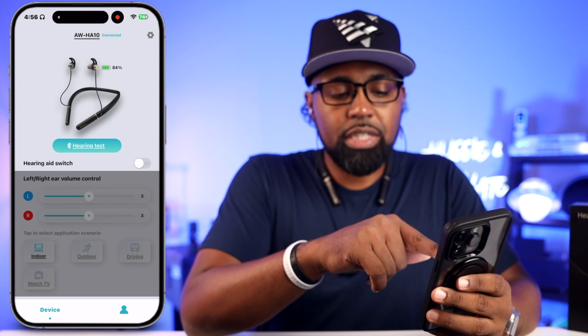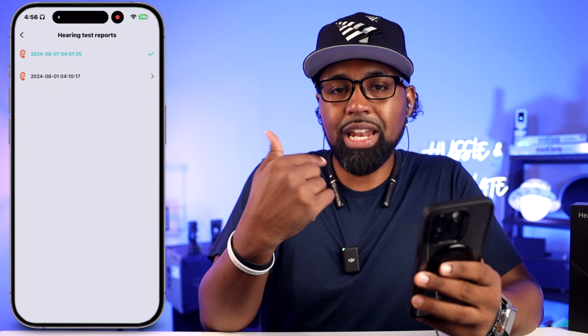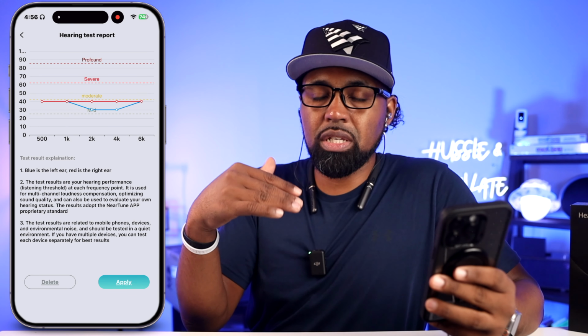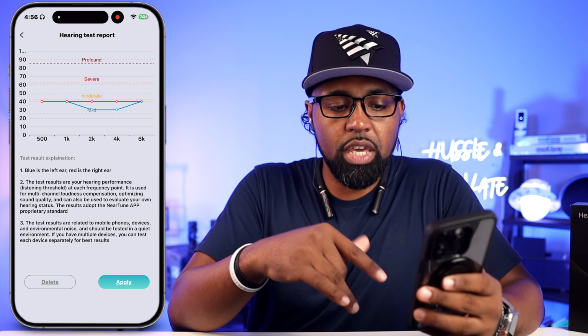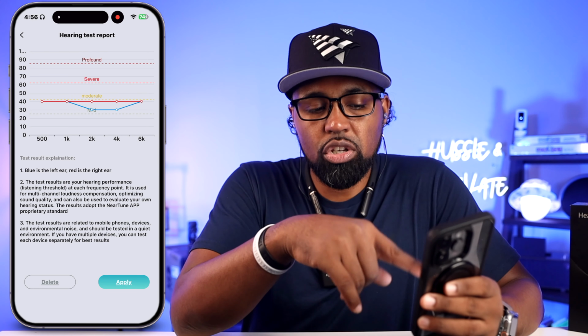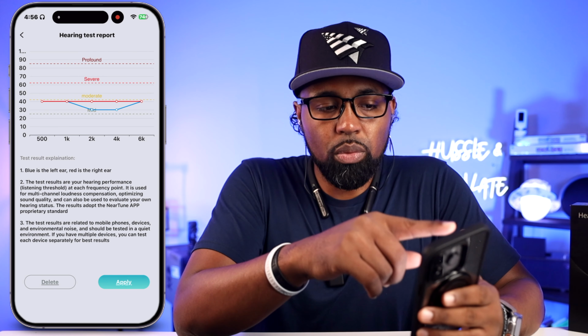You do have your hearing test down here. So I did 2 different hearing tests on 2 different days because I had these for a little bit. Here was my first hearing result. And what I did was just act like I couldn't hear different things, simply because my hearing is fine. So I just wanted to be able to show you what it would look like if there was something wrong with that.